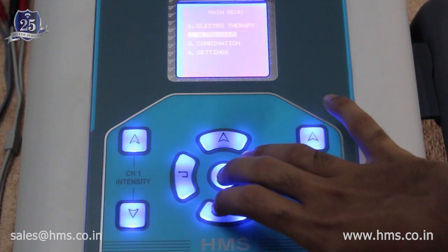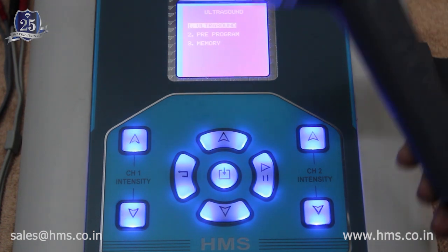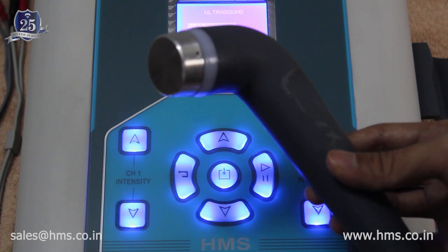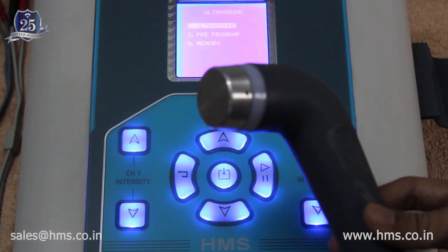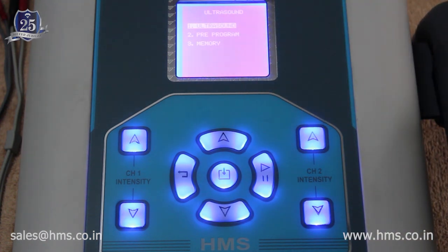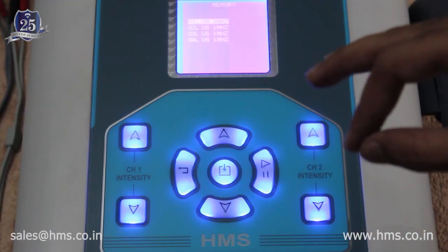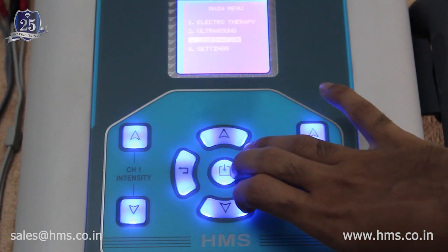For ultrasound, both 1 MHz and 3 MHz frequencies are available, and the transducer supports both frequencies. The transducer is IP67-rated and water resistant, allowing underwater treatment. It also features an order-sensing (auto-sensing) feature that can be enabled or disabled, which benefits both the transducer's lifetime and treatment effectiveness. The ultrasound section includes 47 pre-programs and 30 individual memory settings.